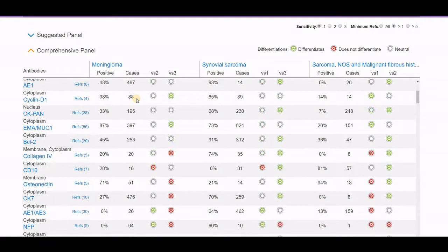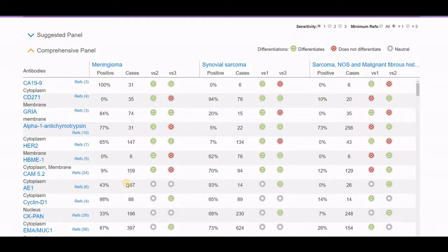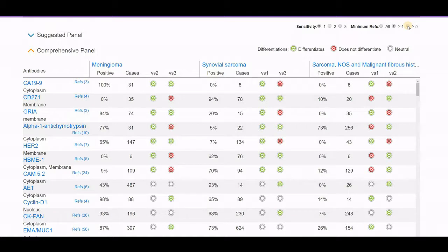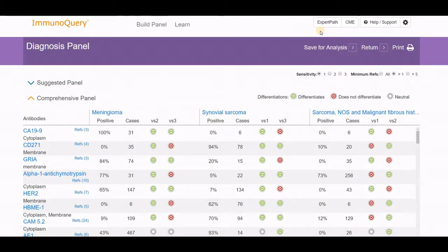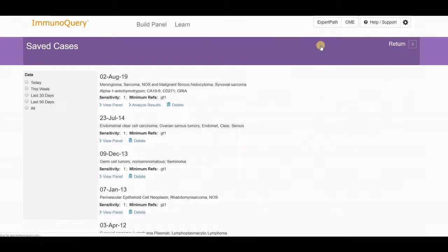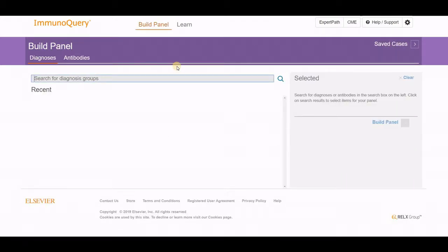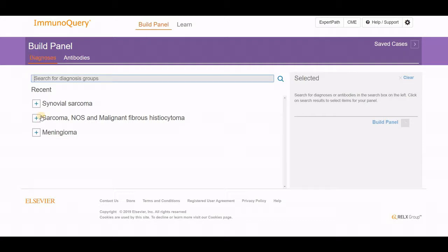The number of cases present, the number tested, and which particular marker may or may not be of assistance is quite helpful. You'll also notice these sensitivities and minimum references. I have this set to at least one reference on the topic. You can change that to more than five references, or have all available references. Same with the degree of sensitivity and specificity. If you'd like to save this for later, you can click save for analysis. It takes a couple of seconds and automatically saves it so you can come back to review it later.